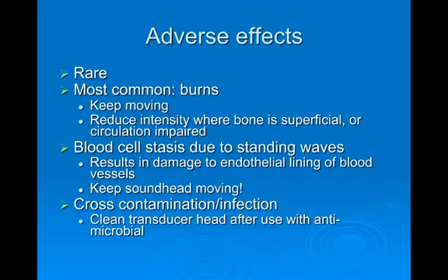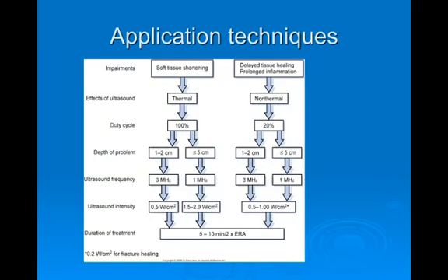Okay, and then another thing that comes up, and this is something to bring into the clinics as you go, because this isn't done very often, is cleaning those transducer heads after every use. Make sure that those are getting wiped down with some sort of antimicrobial wipe, to prevent cross-contamination or infection. All right, so let's talk application techniques then.